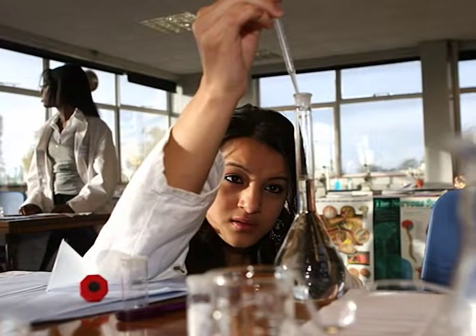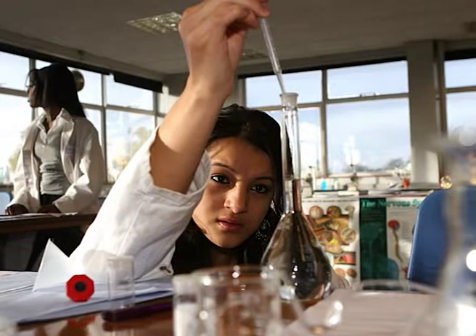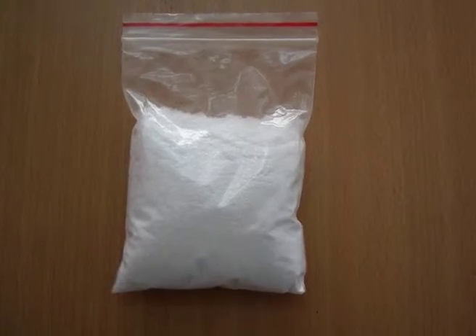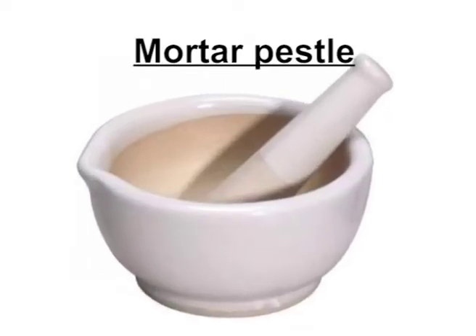Presumptive testing may be made at this stage if it is thought that the sample homogenization process will be lengthy or if there is still some doubt as to the identity of the material. For blocks, representative samples should be taken from all surfaces including the center region, or else the total brick is ground to a fine powder. The powdered material is placed in a clean, clear plastic bag and shaken thoroughly. If the powder contains aggregates, these may be broken down by passing through successively finer sieves, by pounding in a mortar and pestle, or by use of an adapted commercial food mixer or food processor.